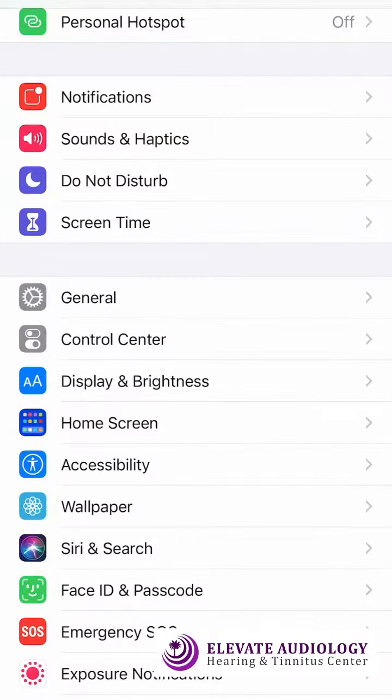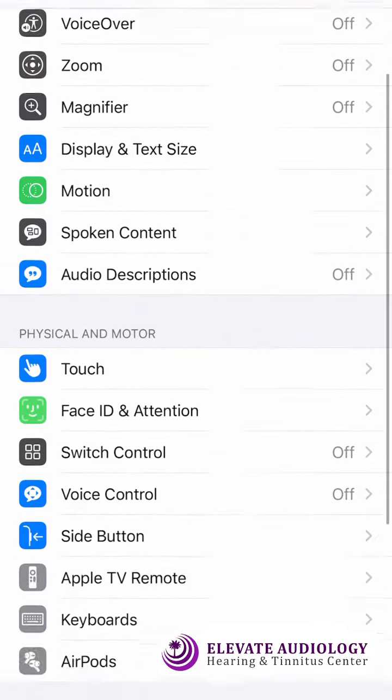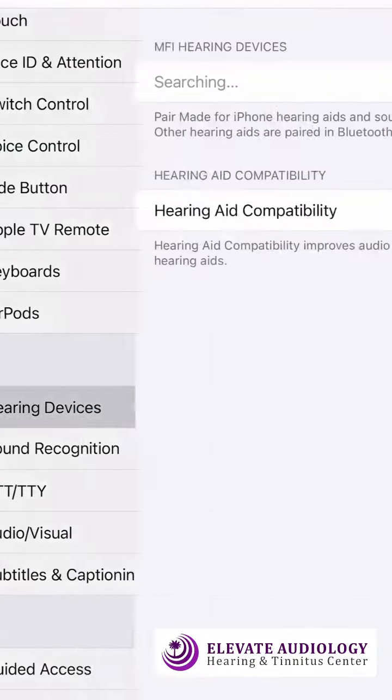And then you're going to want to scroll until you see accessibility. And then you're going to want to click on that. And then you're going to scroll a little bit more until you see hearing devices. So you're going to click on that.